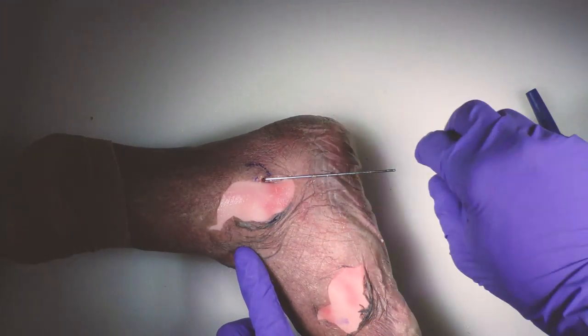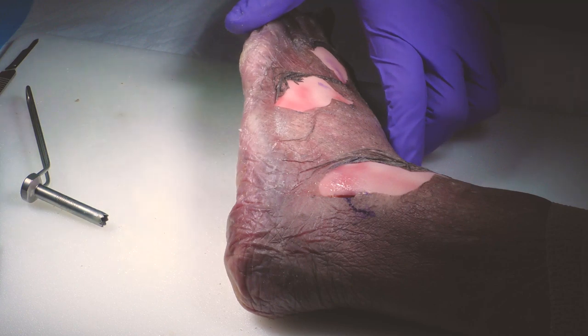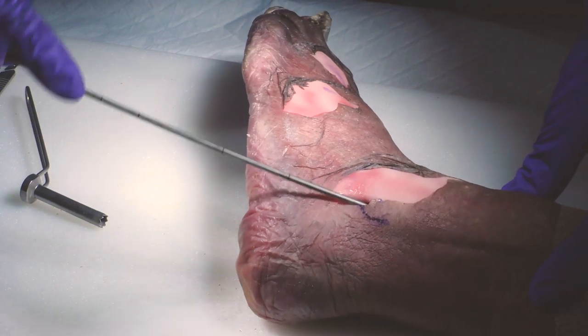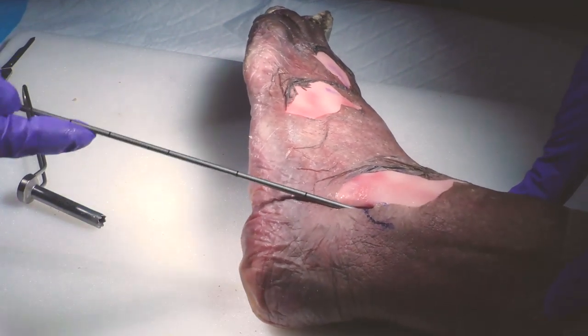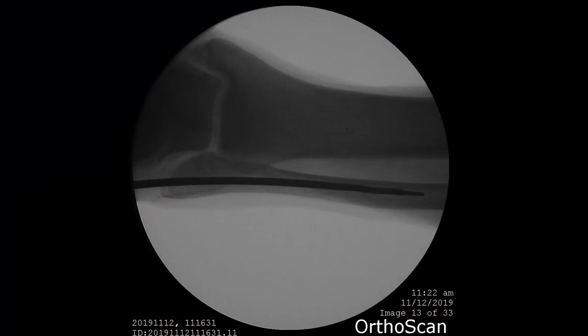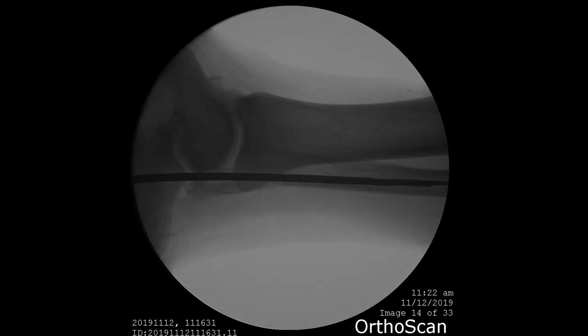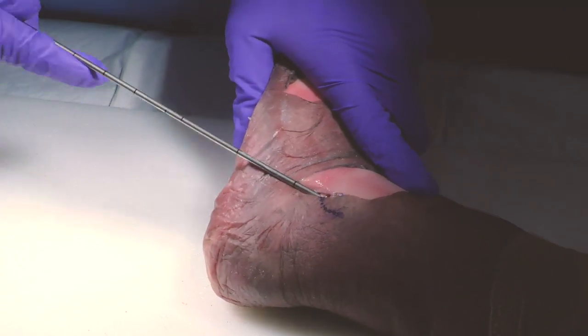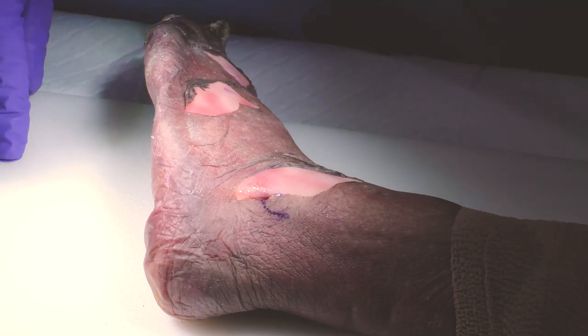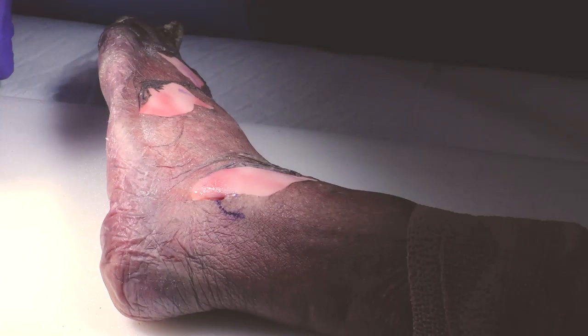So now that we have done this, we can remove the K wire. You can use two sleeves in order to see what size of nail you're going to use, and you need to have a sense that you are inside the canal. So I'm going to double check again — this is what you want to achieve: that you are inside the fibula on the lateral view and the AP view. You have two sleeves and they help you decide what size of nail to use, because you have two widths and each one has three lengths.